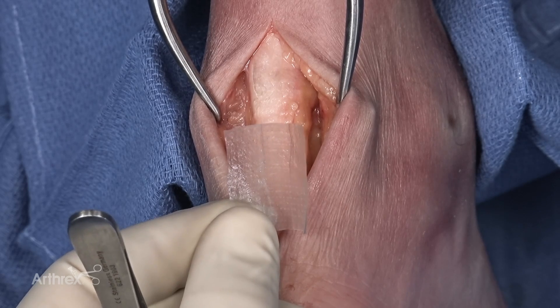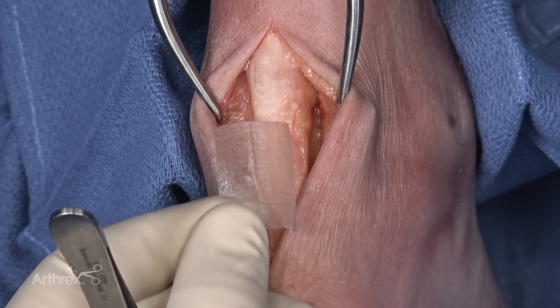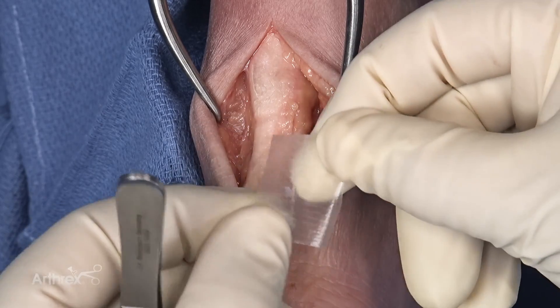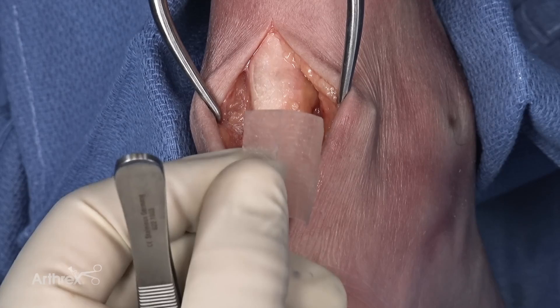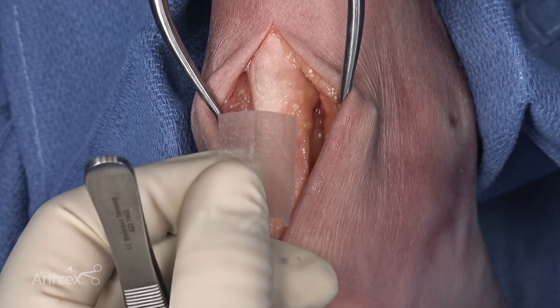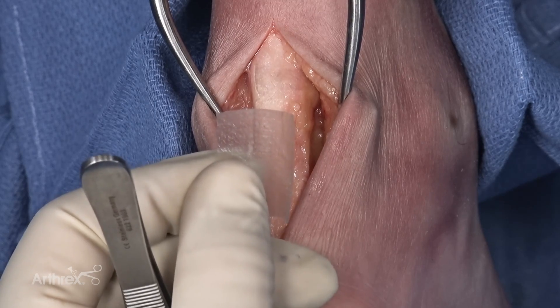Centiflex will be utilized as an augmentation around the tendinous structures to assist in the repair. As you can see, Centiflex is a high tensile strength product. It can be folded, twisted, turned, and it doesn't tear. It receives suture in a very acceptable fashion, so you do not have to worry about the suture pulling through the scaffold when doing your repair.